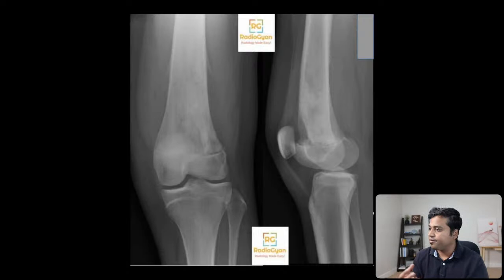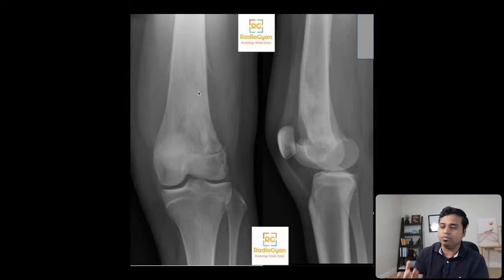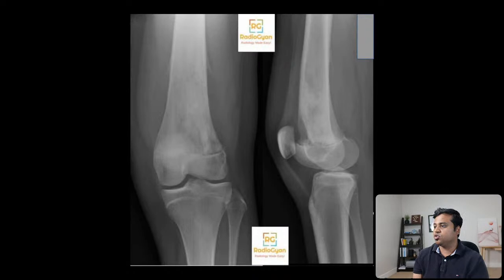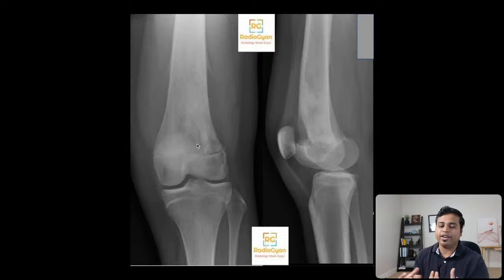There is a permeative lesion around the distal femur. The zone of transition is wide — we decided this is an aggressive lesion involving the distal femur. Look at the matrix: is there ring-and-arc calcification? No, we don't see that. Is it similar to the remaining bone, or is it sclerotic osteoid matrix? It is an osteoid matrix. Osteomyelitis is a great differential for this location — in the pediatric population, there is a hairpin bend of vessels at the metaphyses causing stasis of blood, which is why infections are more commonly seen around the metaphyses in children.